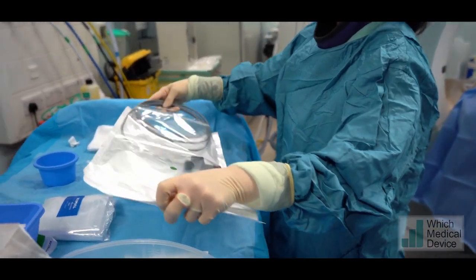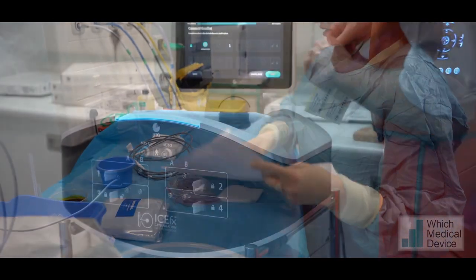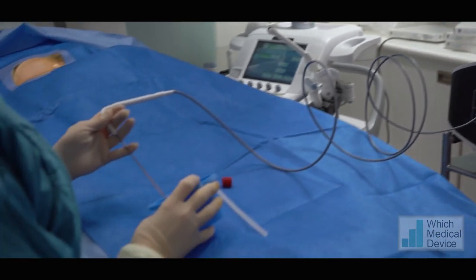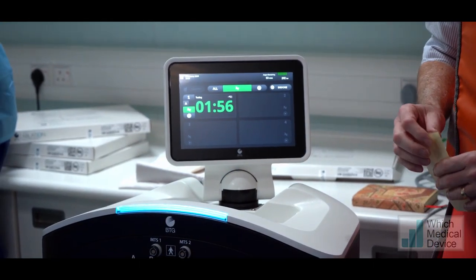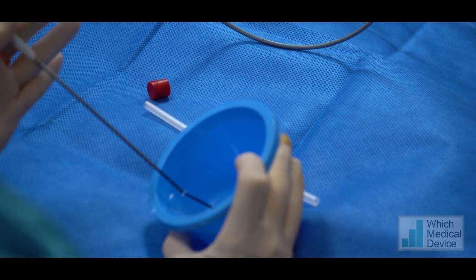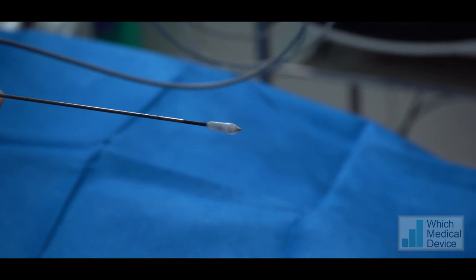First we open the packet to take the ice pearl needle out and lay it onto our sterile field. We then prep the skin — all of this is done in the CT scan room, also with ultrasound guidance if needed. We then test the needle in saline, cooling it with argon gas.